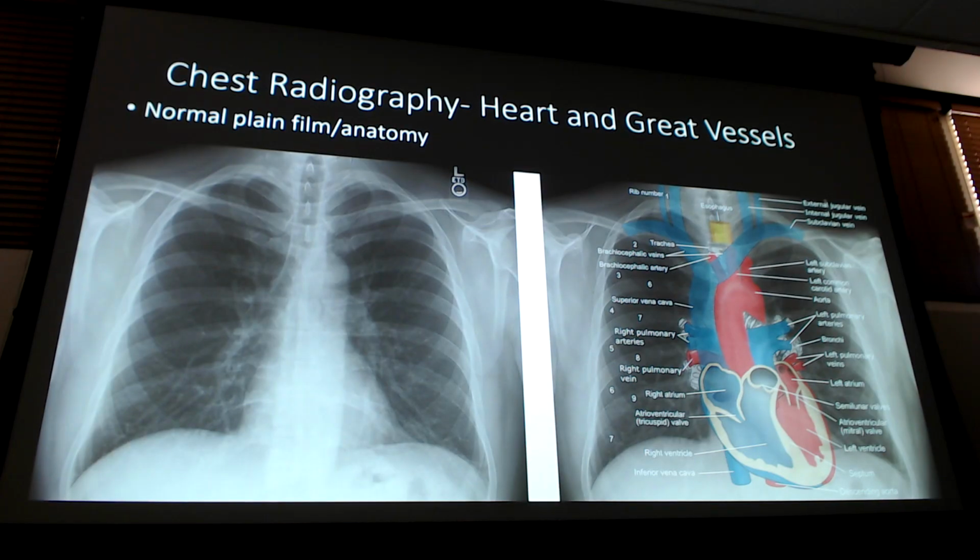Hey, look. Another annotated image to show you what's normal. This one takes it a little bit further. This one starts to show your superior vena cava coming up a little bit. It starts to show your aortic knob a little bit, and it breaks down how the heart looks and how the heart is structured with the valves and the chambers, right? So again, look where my right ventricle is, hiding right down here, kind of projected into the belly a little bit, but behind the spine.